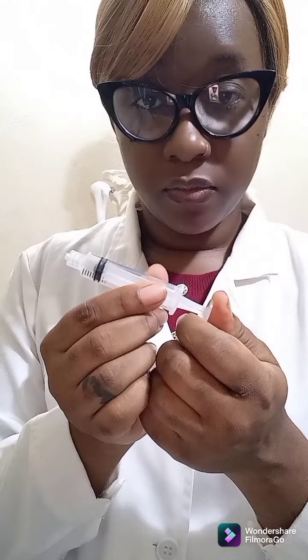Always remember to remove air from the syringe before performing a venipuncture because we do not want air to enter the patient's vein, because air bubbles could travel to the patient's brain, heart, or lungs and cause respiratory failure, stroke, or heart attack.